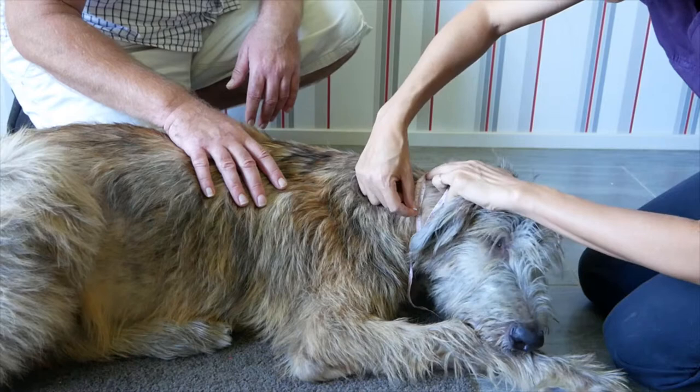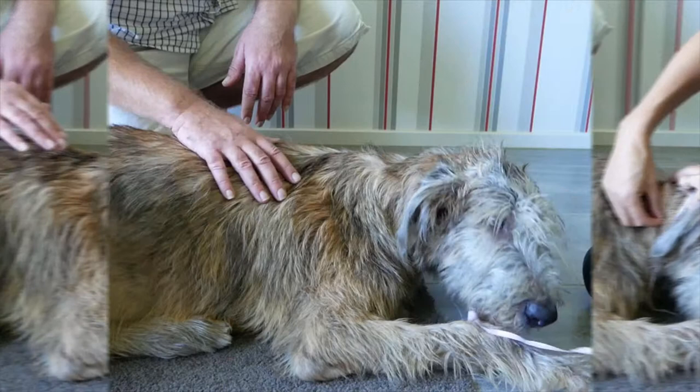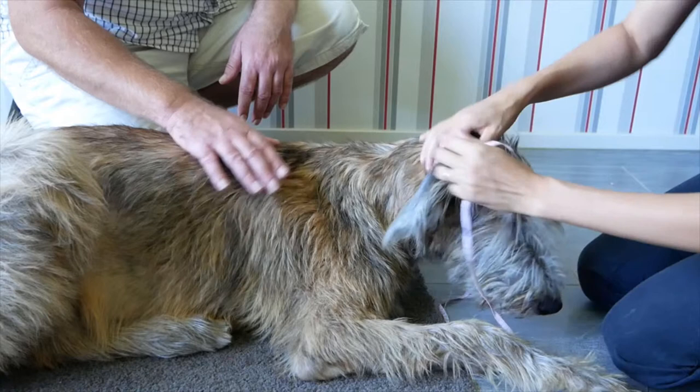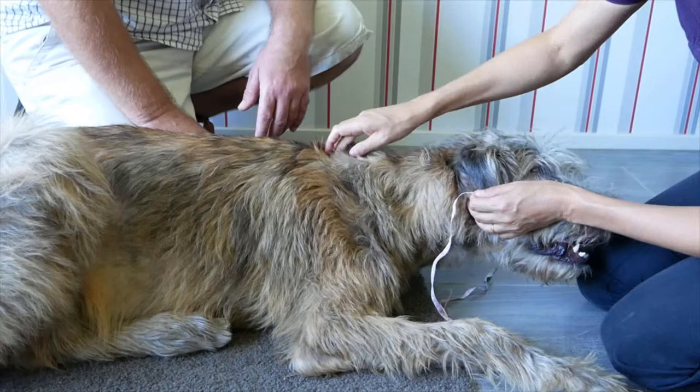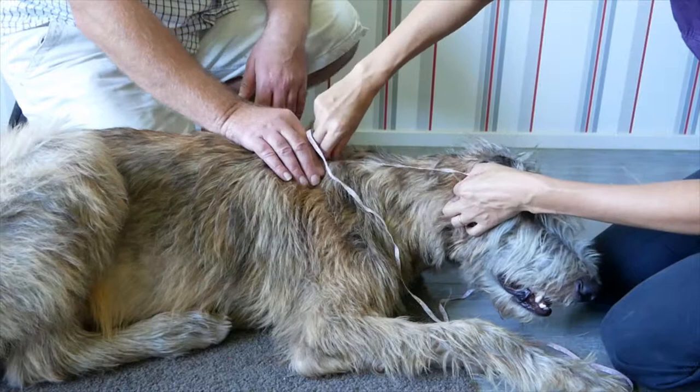This first measurement refers to the distance A and can be assessed on the size table on the website. Now measure the dorsal length of your dog's neck. Locate the knuckle behind the ear of your dog, then locate the distance up to the interscapular area, just above the alignment of the front leg. It is the long length of the brace, referred to as distance B.